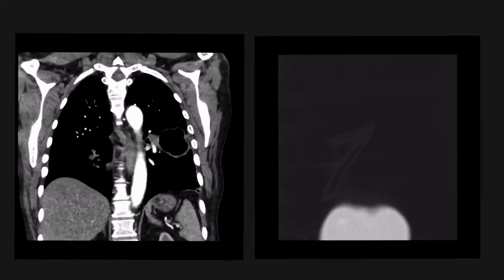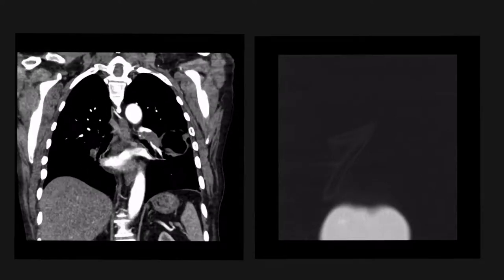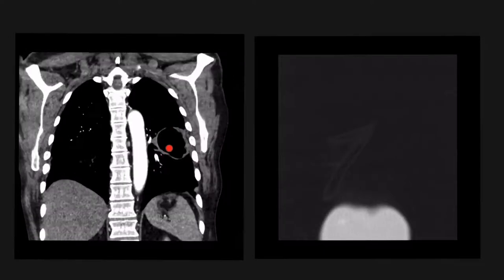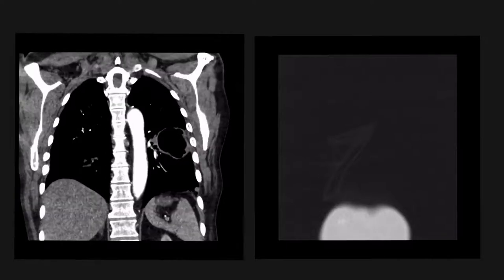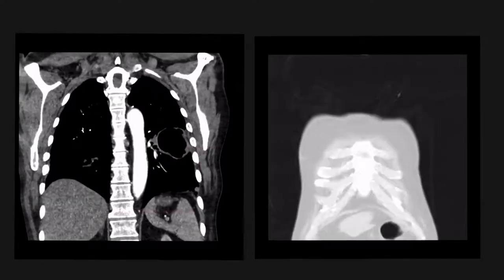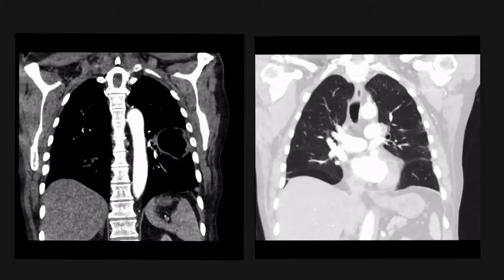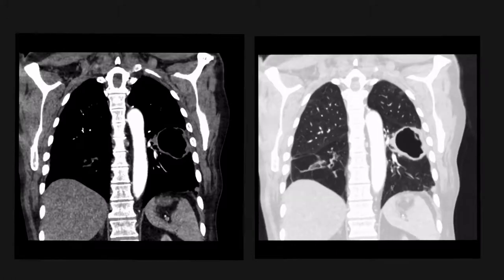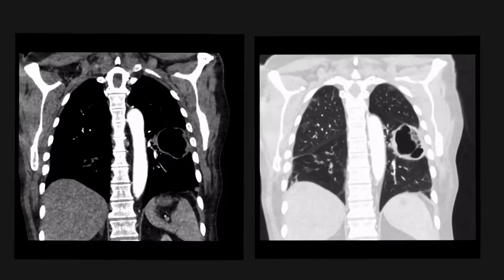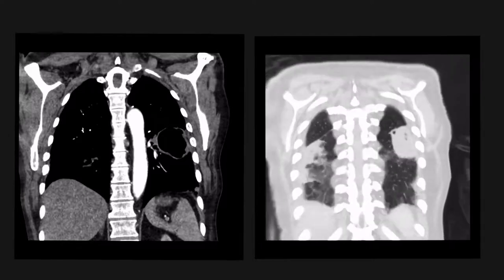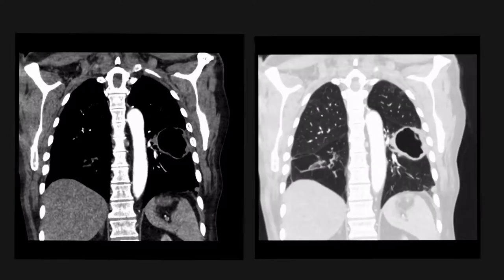On the CT chest in the same patient, there is extensive thrombus in the left main pulmonary artery, and the abnormal lesion is seen in the territory supplied by that artery, in keeping with an infarct. On lung windows this confirms a cavitating lesion. This was a pulmonary infarct in a patient who had a pulmonary embolism.